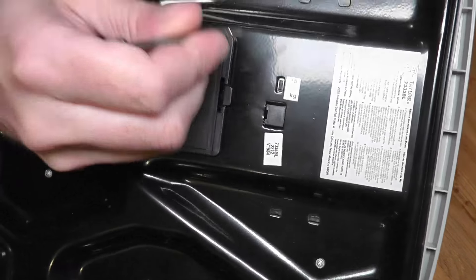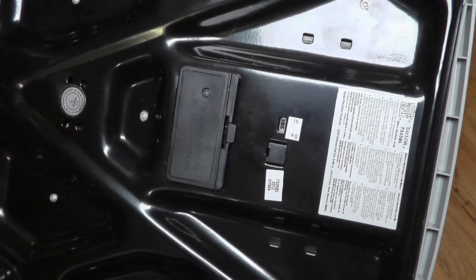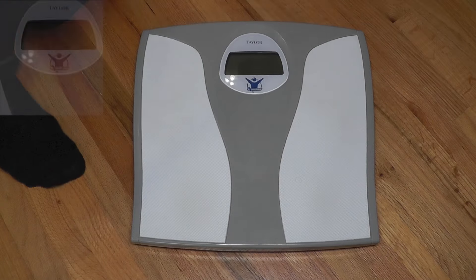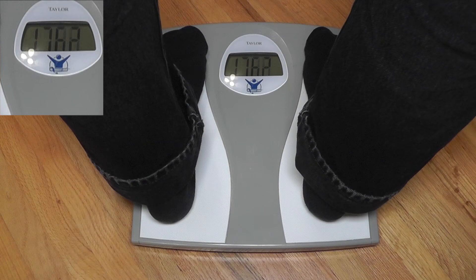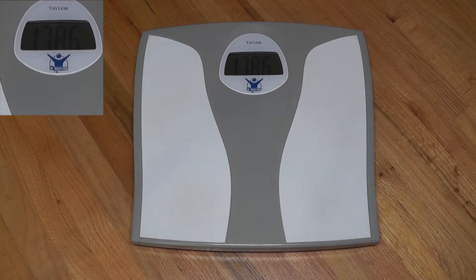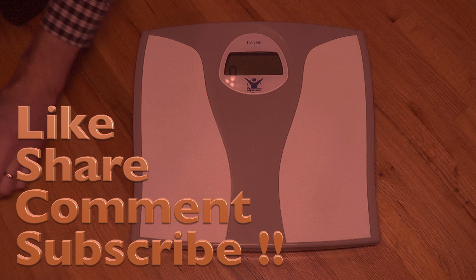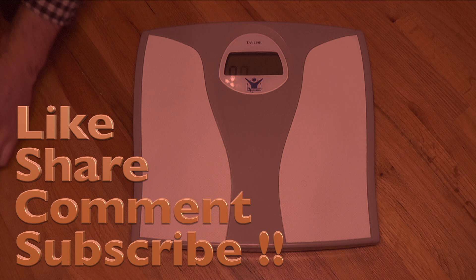Now let me show you how to switch this back to pounds. We're going to turn it around again, go back to that little switch which is currently set to kilograms, and switch it back to pounds. Using the small screwdriver, I put it back on the floor and now it reads 178 — and that's in pounds. Perfect. See how easy it is?